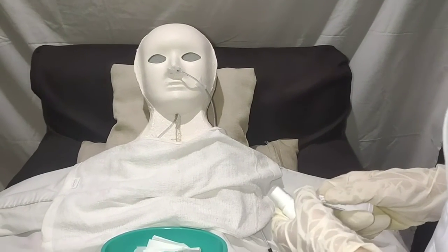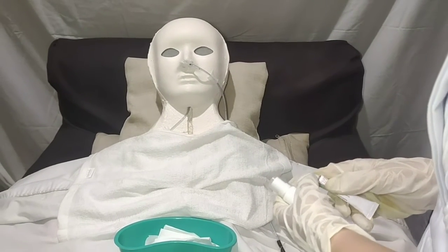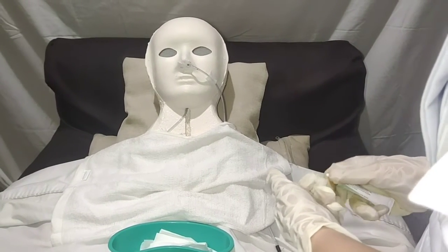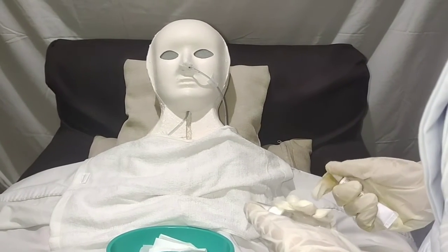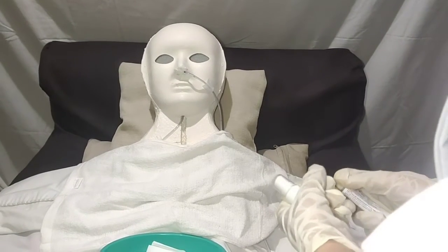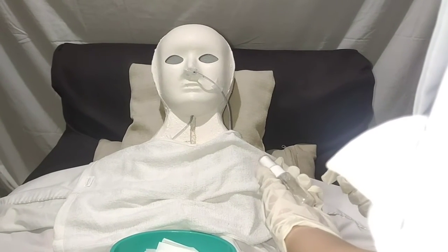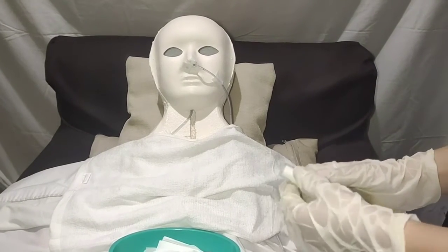Next is assist or provide oral hygiene at 2 to 4 hours interval. Lubricate the lips generously and clean nares and lubricate as needed. Offer analgesic throat lozenges or anesthetic spray for throat irritation if needed. Ma'am, we are already done with the procedure. And I am going to lubricate your lips as well as clean your nares. And this is also the anesthetic spray for your throat irritation, and use this at 2 to 4 hours interval.